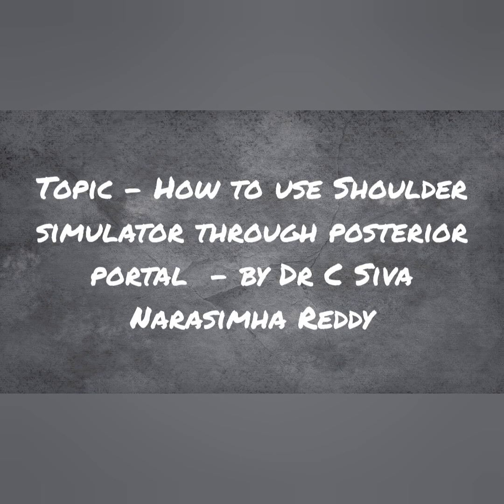Topic: How to use shoulder simulator through posterior portal by Dr. C. Siva Narasimha Reddy. Today I'm going to show you the diagnostic arthroscopy of shoulder. How to do a diagnostic arthroscopy in a shoulder model.